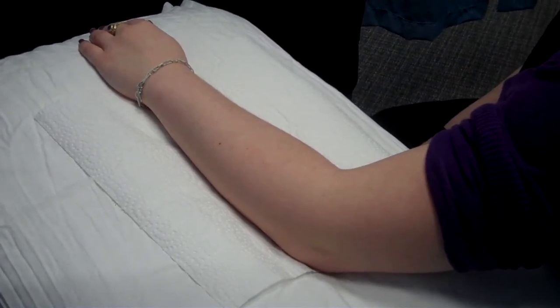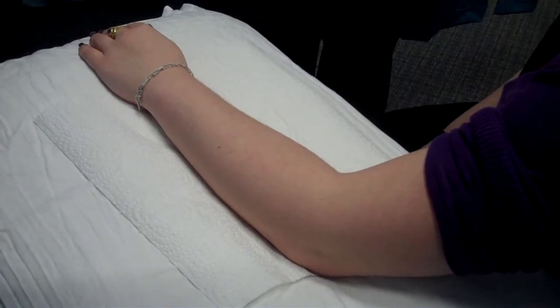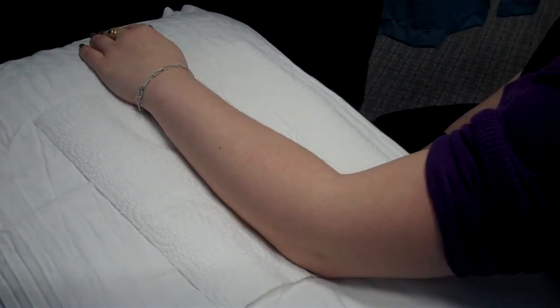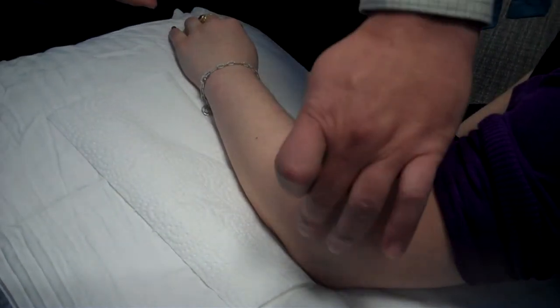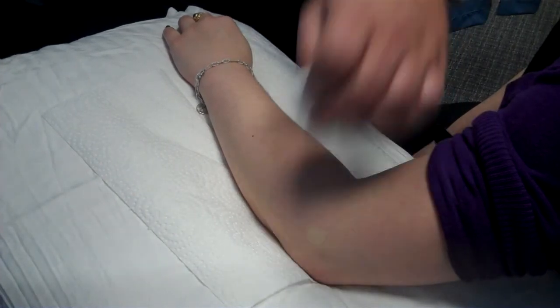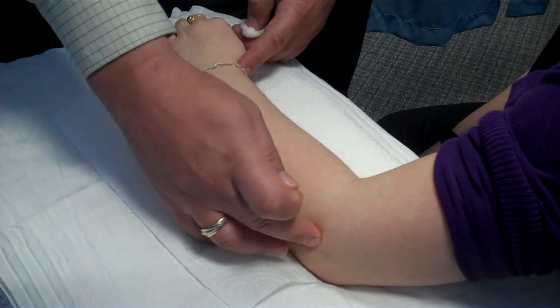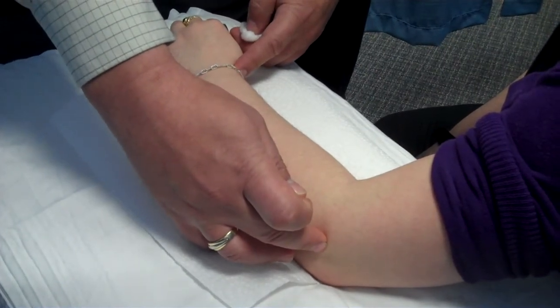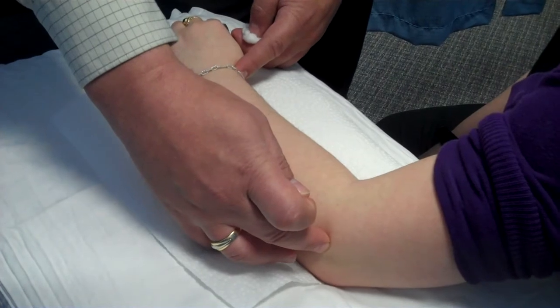The first one I want to demonstrate is extensor carpi radialis longus. The way we locate this point, there are two landmarks. The first landmark is the tip of the lateral epicondyle, and the second landmark is the anatomical snuff box. This point is located a quarter of the distance from the line drawn between the two landmarks.